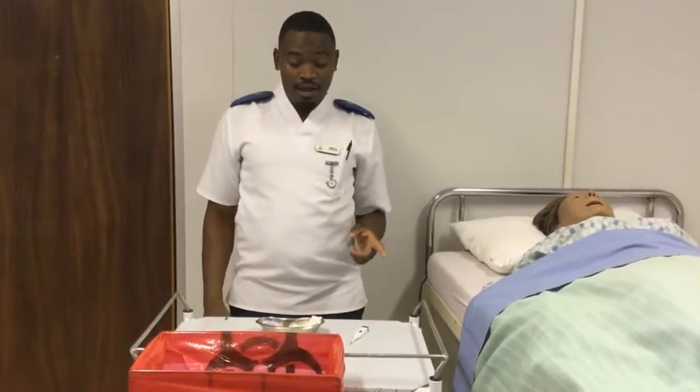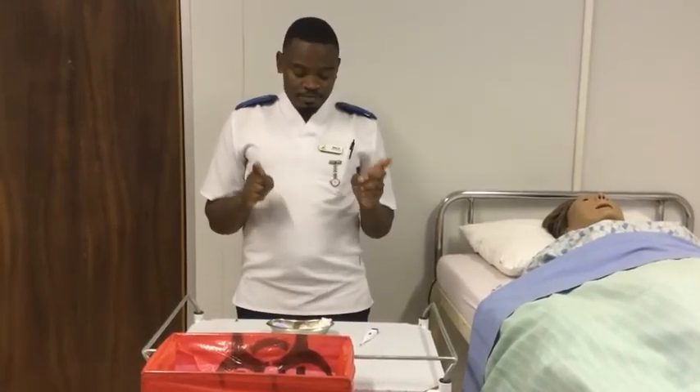Welcome there learners. Today we are going to learn how to perform TPR — that is temperature, pulse and respiration.